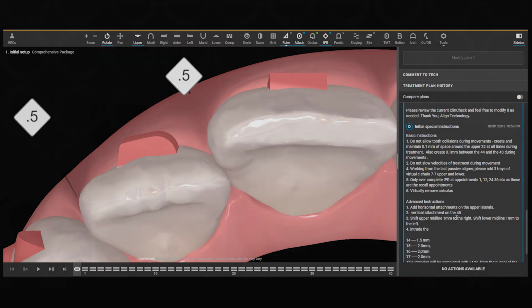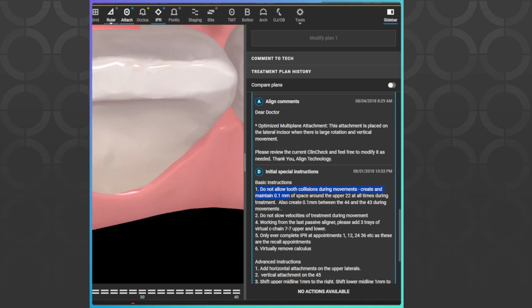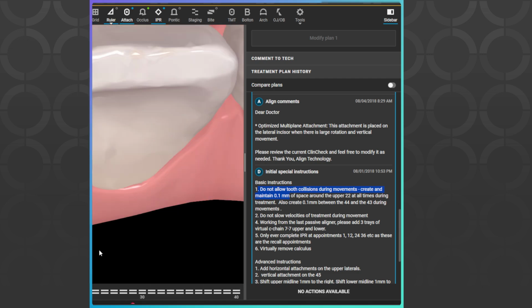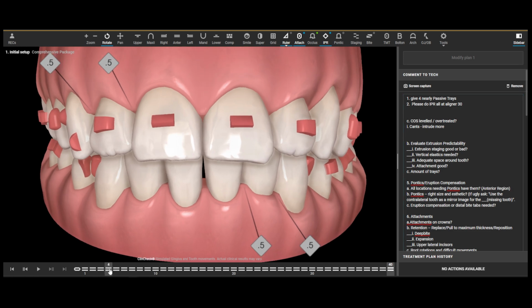I'll show you here. The instructions I actually gave to the technician here was, do not allow tooth collisions during movement. Create and maintain a 0.1 millimeter of space around the upper 2-2 at all times during treatment. So around this upper lateral, because it's a hard movement, I've specifically asked them to create space around it so no friction happens until the IPR occurs, and then they can close the space. Right? It makes sure that this is going to track and work properly. So round tripping is present. Are we going to remove it? No, it's fine.